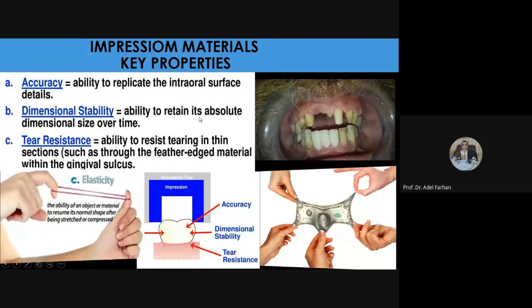بالimpression due to the contraction of the material after during polymerization يسوي shrinkage. فهذه واحدة من reaction polymerization، أو احتمال اكو باي برودكت تطلع من الماتيريال after setting يسوي لنا أيضا dimensional change or water absorption from a wet or a humid environment هم مسوينا change، او any change in the temperature. يعني اذا طلعت impression وخليتها في مكان حار جدا او بارد جدا ممكن نسوي لنا ايضا change and incomplete recovery of deformation because of viscoelastic behavior of the material.